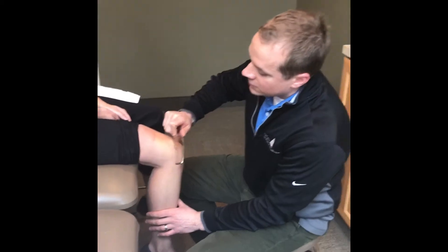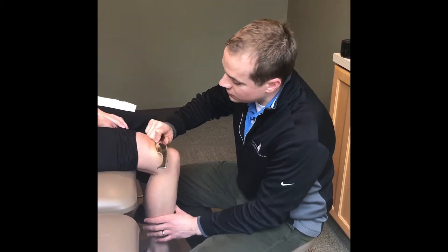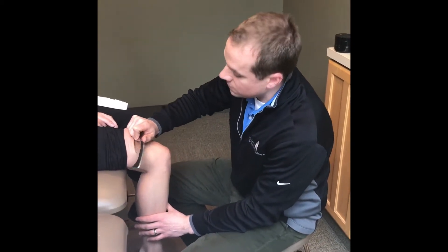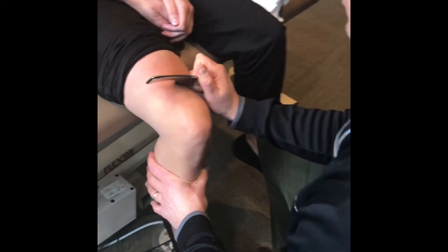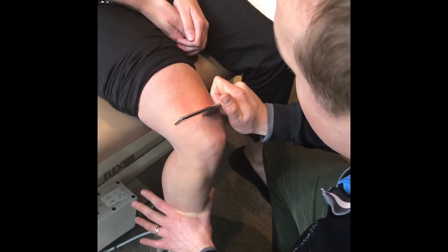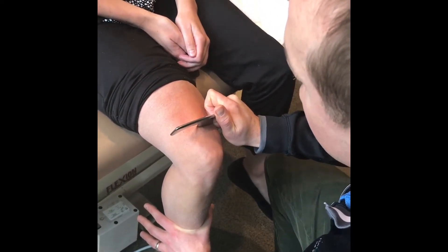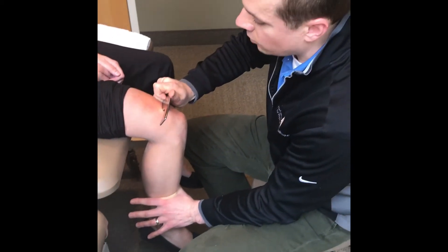Another benefit to using instruments for soft tissue mobilization is getting different layers between the skin to actually glide better. As I glide through your quadriceps tendon and quad muscle, I'm feeling for restriction. To apply treatment, I can have you push into my hand for two seconds and then relax — a gentle but unique load into the tissue of your quad and quad tendon.